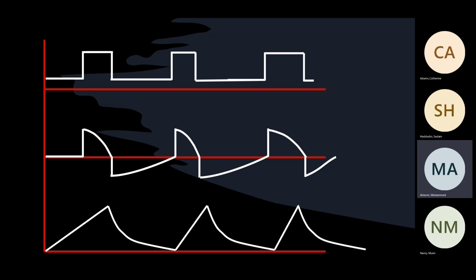This one was for Haru. All right, Mahmoud, it's you, unfortunately. You're the last one. What's that? Pressure control. Why did you say that? Because the pressure is the same. That's right, and the flow is changed. Good. And is it CMV, IMV, or CSV?